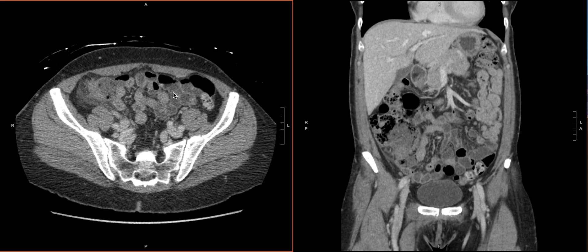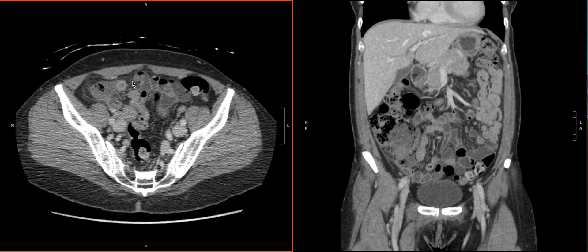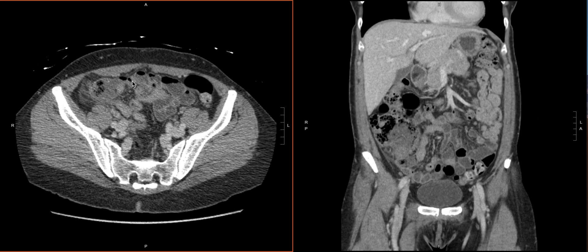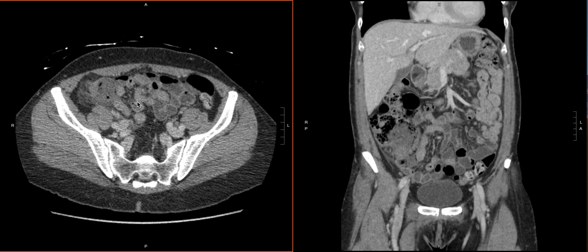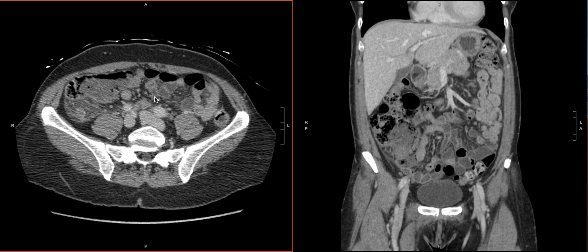One is the actual terminal ileum. Looking here, I think this is it right there, and it plugs into the cecum over here. We can confirm that by going back and forth and tracing that small bowel, just making sure that it plugs in here — and it does. So that's the terminal ileum identified, and usually the ileocecal valve helps us notice that as well.